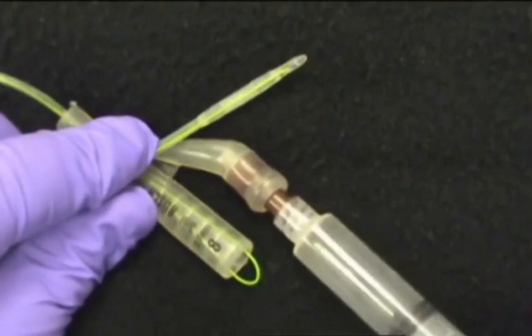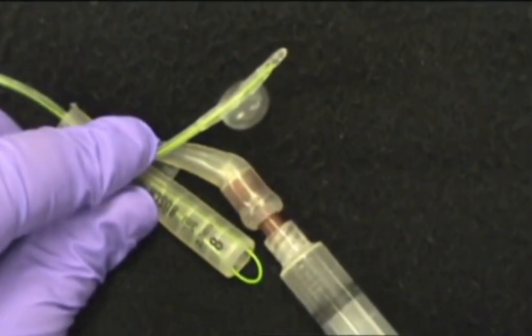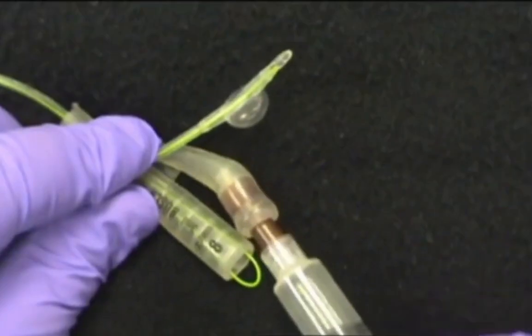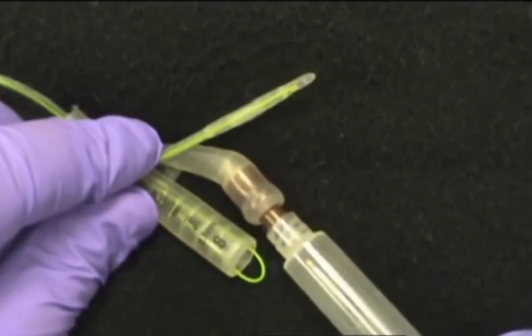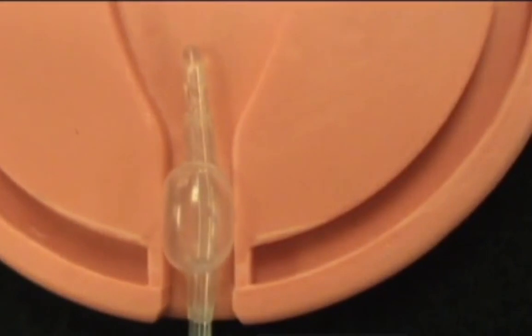One way to decrease the leak is to use a balloon tip catheter. After inserting the catheter, the balloon tip is inflated before the saline is injected. The inflated balloon blocks the leakage of saline through the cervix. The best seal occurs when the balloon is inflated within the cervical canal. However, this may cause cramping pain.